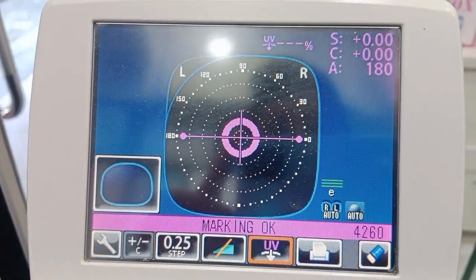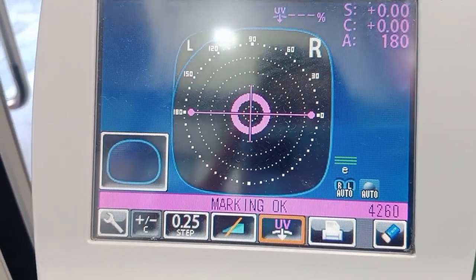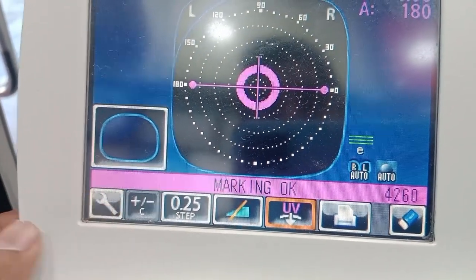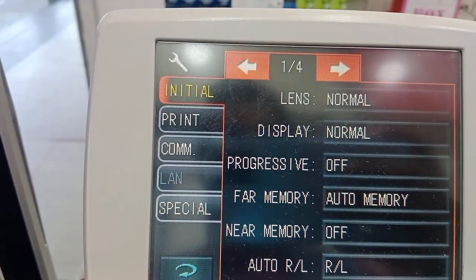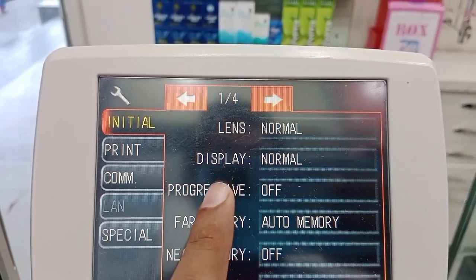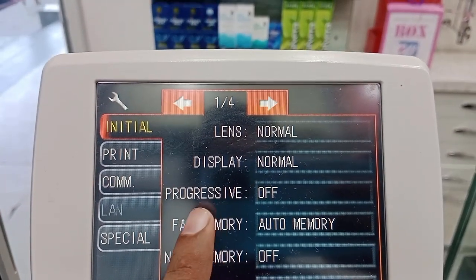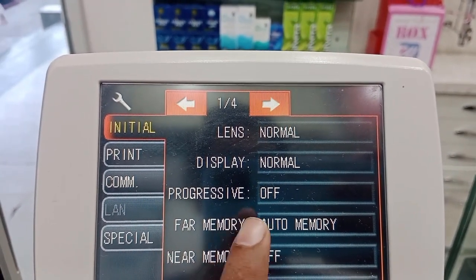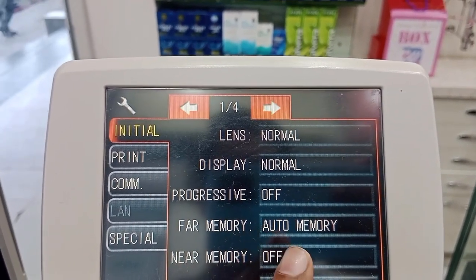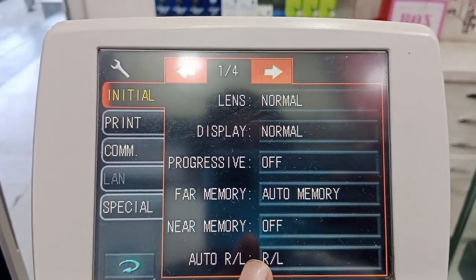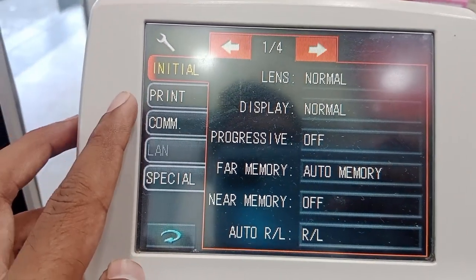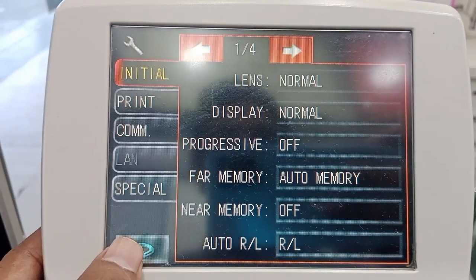Now on the screen we have different settings. The first button is for settings. If I press it, you can see the different settings available. You can change the lens display for progressive — this is the setting for progressive. You can also change settings for memory and near memory.